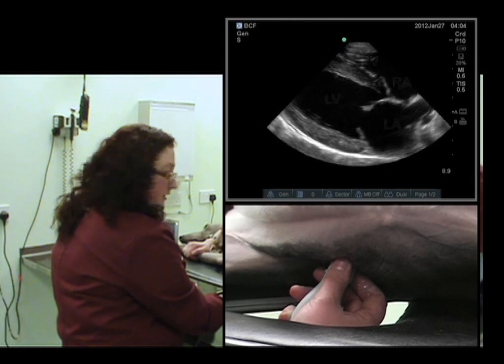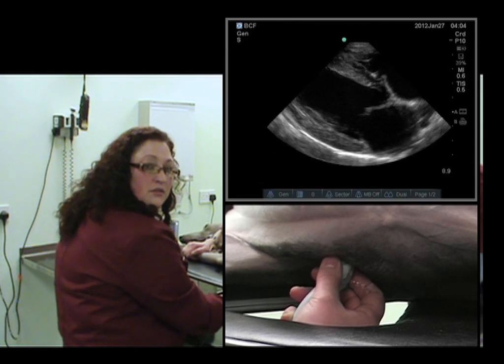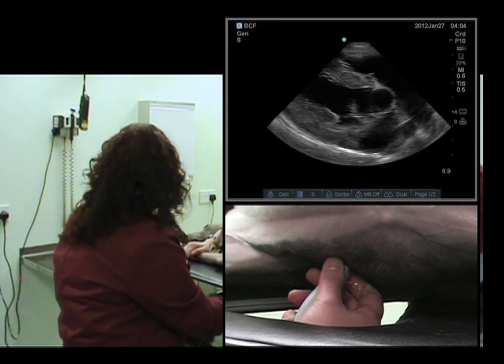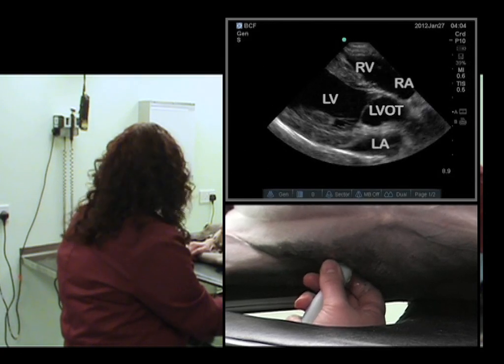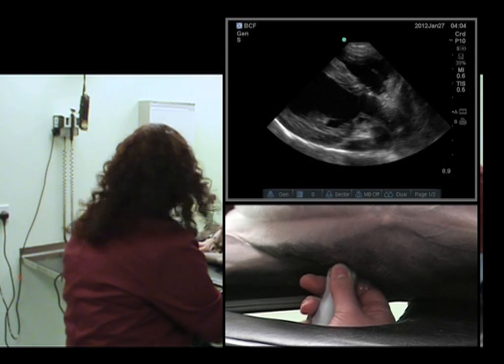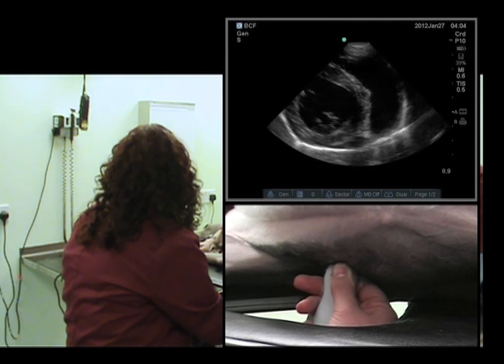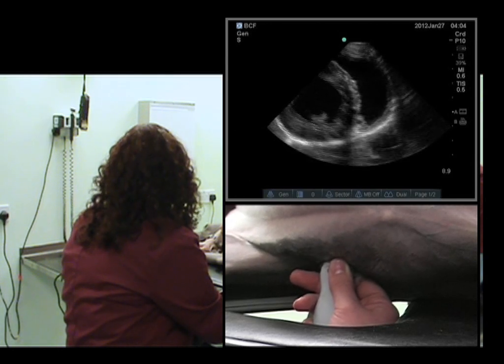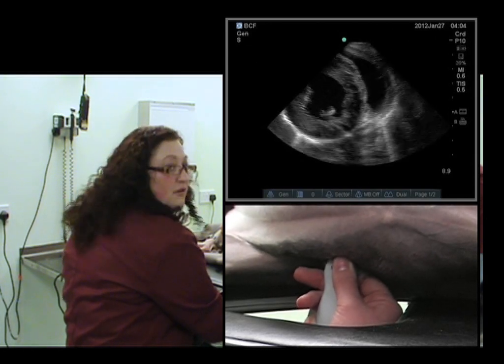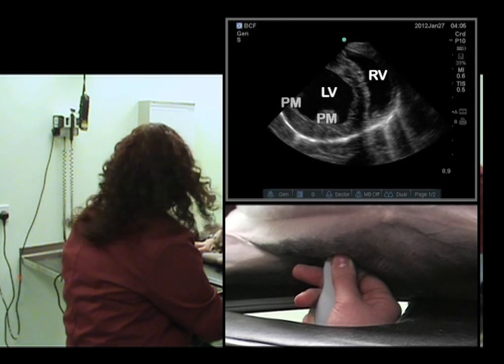Now we'll rotate anti-clockwise — thumb to bum — in order to get the short axis views. We obtain the five-chamber view and continue to rotate. We then have the short axis view at the level of the chordae tendineae, with the papillary muscles in view.